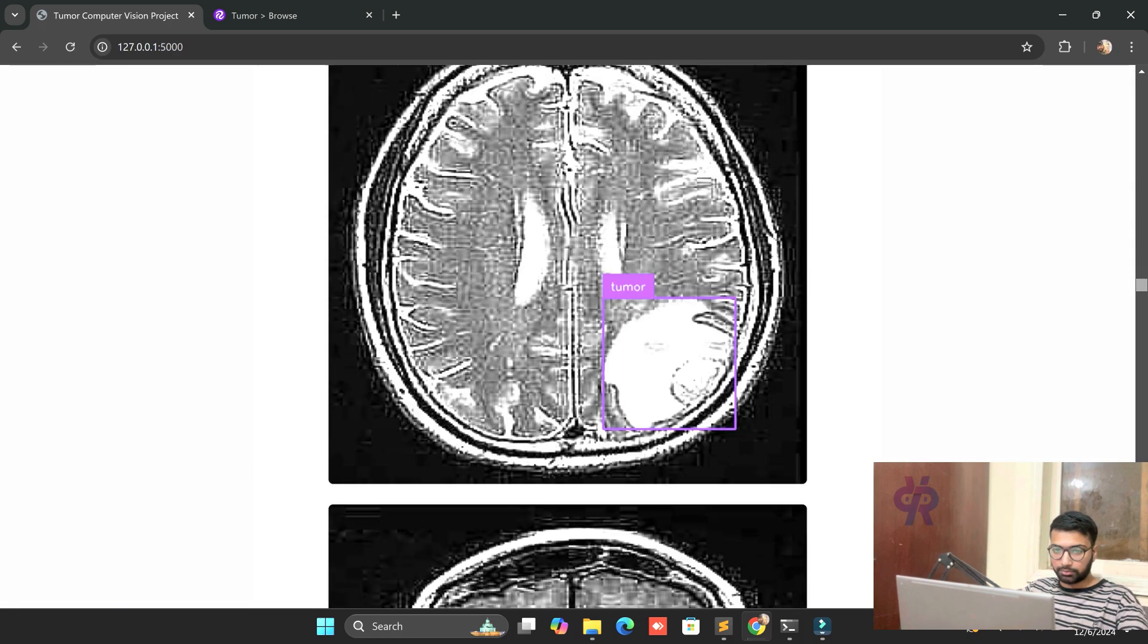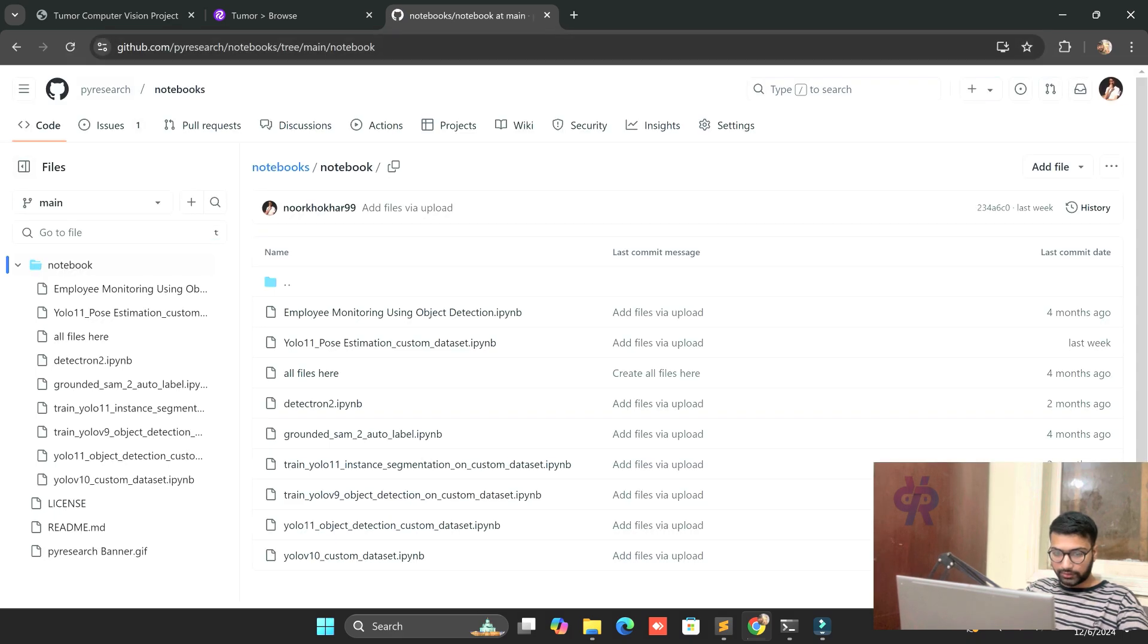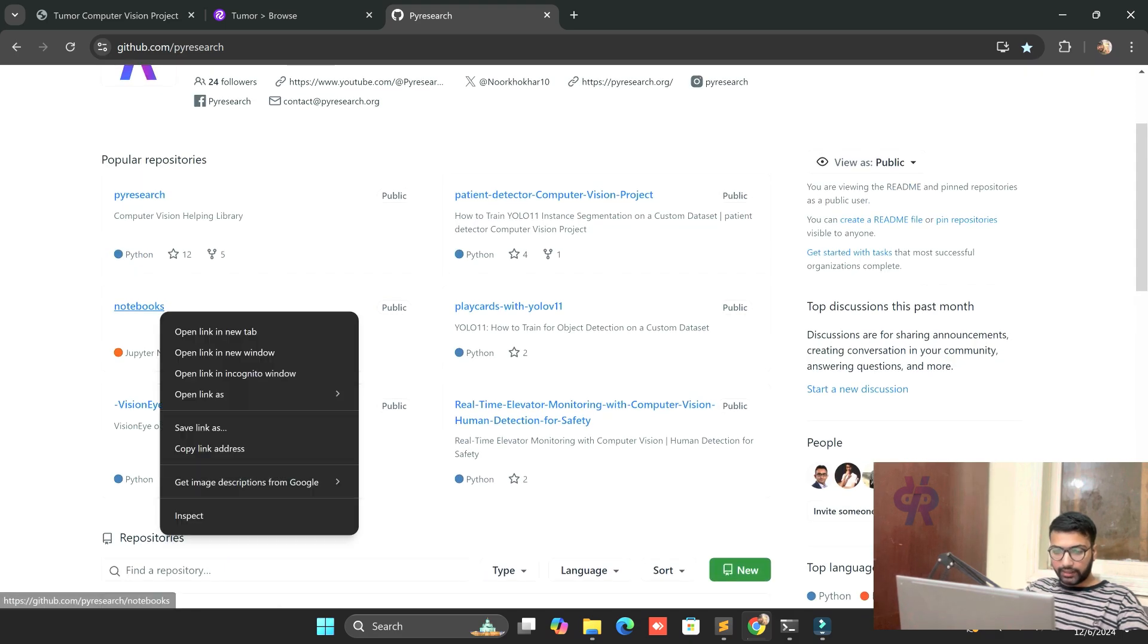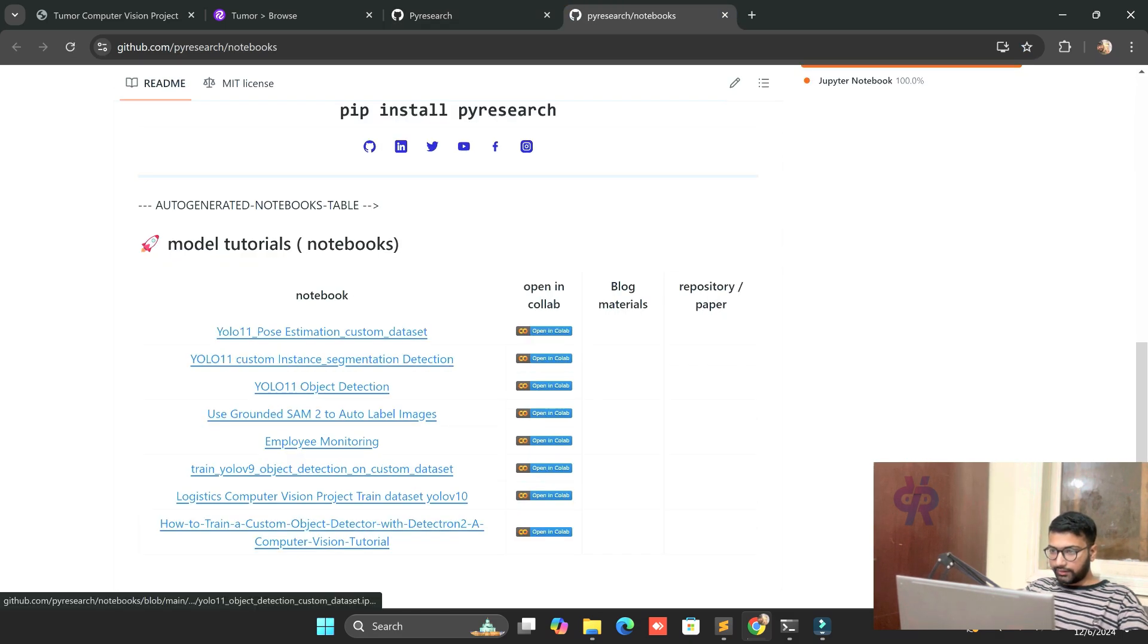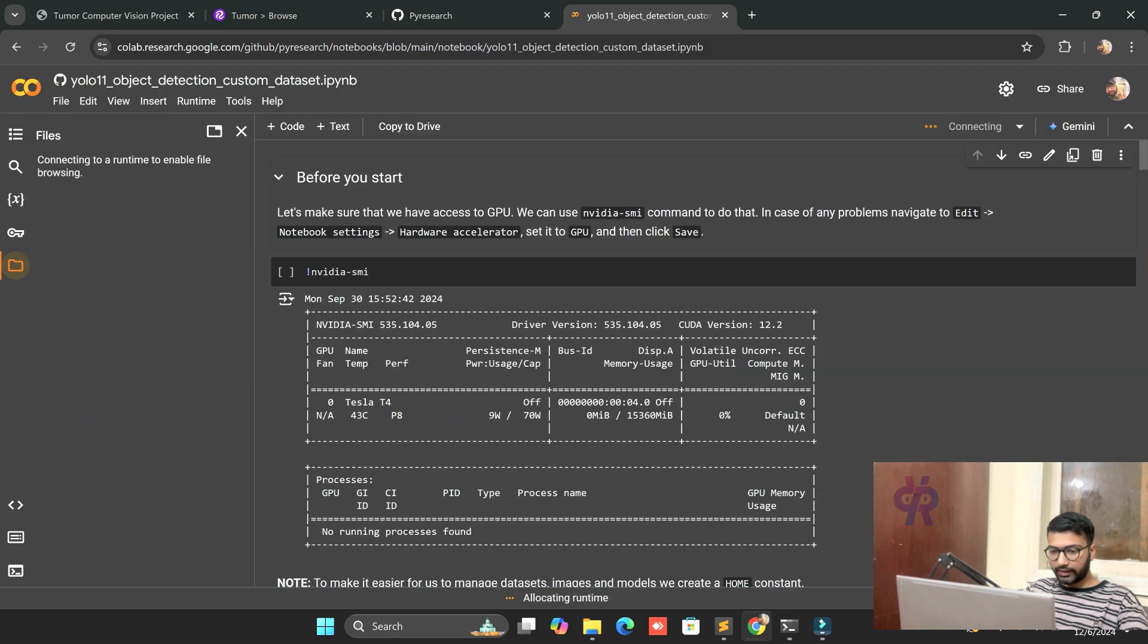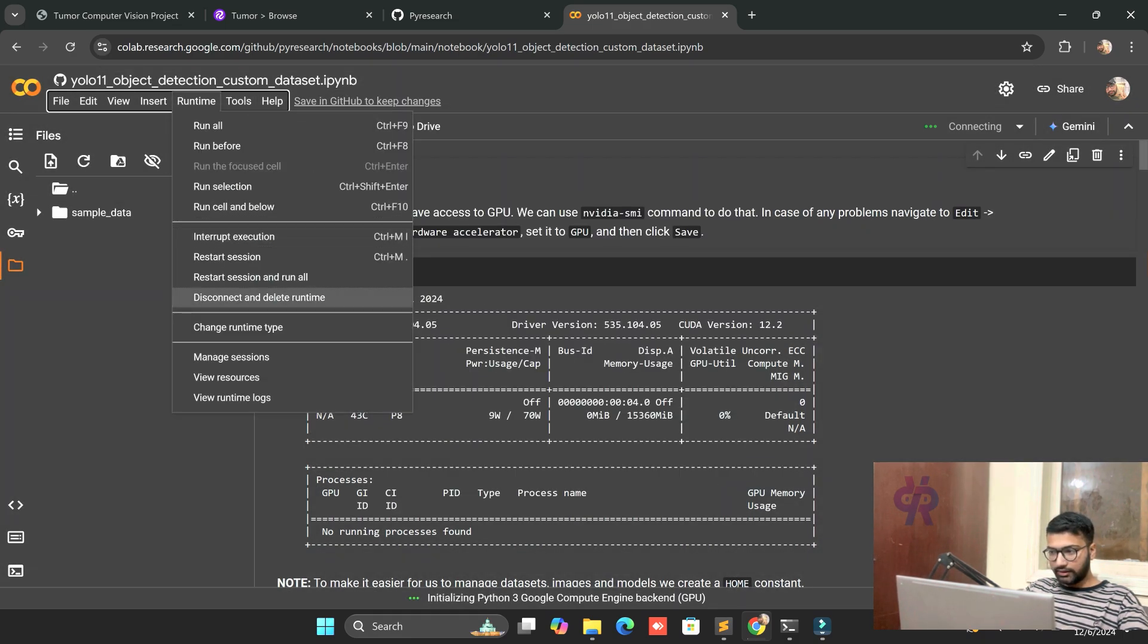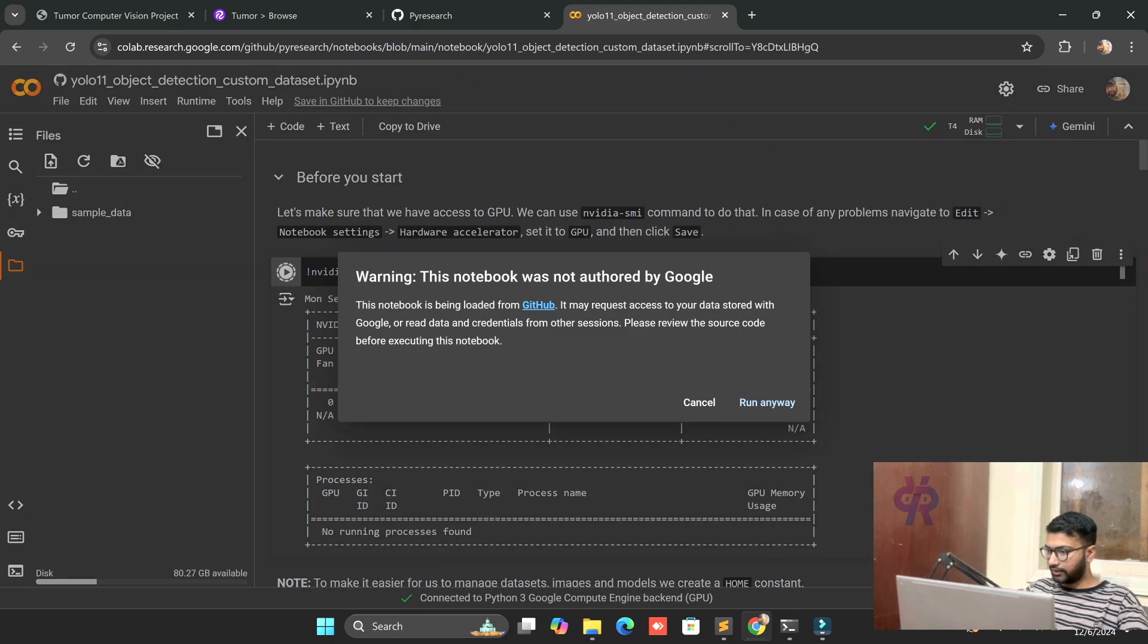You go to Google Colab notebooks and the PyResearch platform. Open the notebooks. Now open the YOLO 11 detection file, and after opening successfully, connect first. Go to Runtime. This one we connect, but you change here to T4 GPU, and it's successfully done. Now we need to initialize our GPU, and it's successfully active.